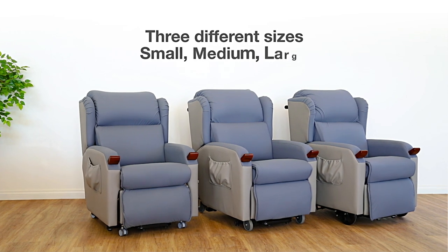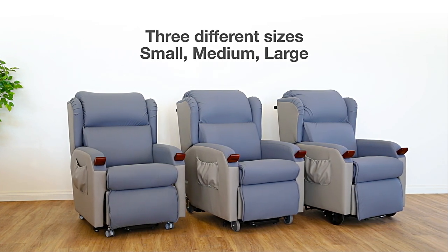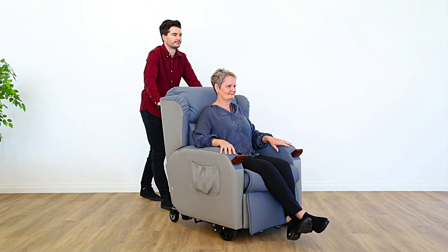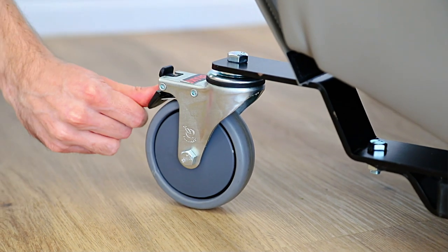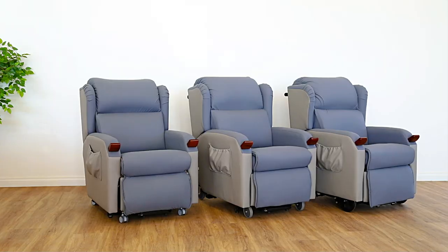The Compact Lift Chair comes in three different sizes and a range of custom colors and material options, also available in the Compact Mobile and Compact Premium Mobile lift chair models. Designed with healthcare workers' health and safety front of mind, these models feature an ergonomic push handle for easier maneuverability, larger sturdy lockable rear casters, and a foot attendant brake on the Premium Mobile.